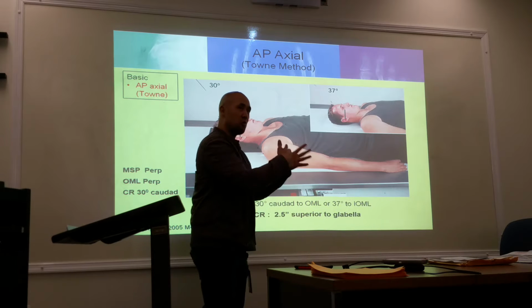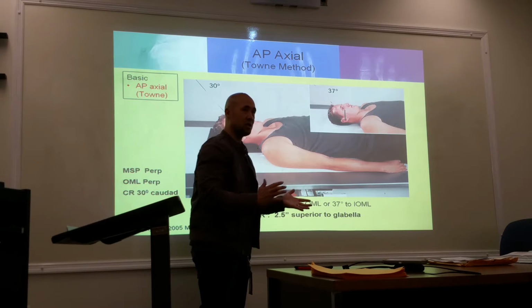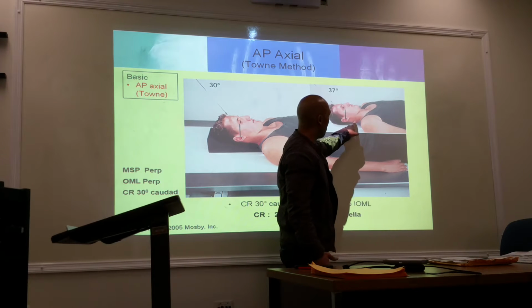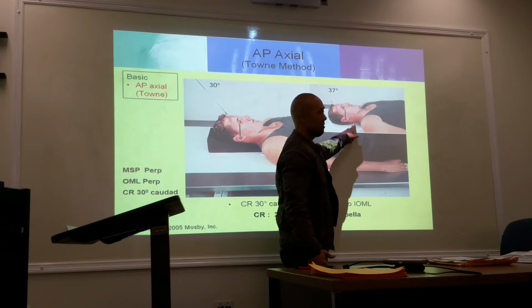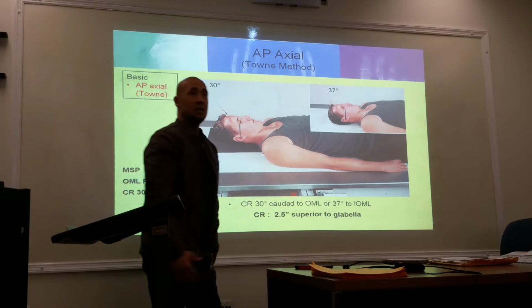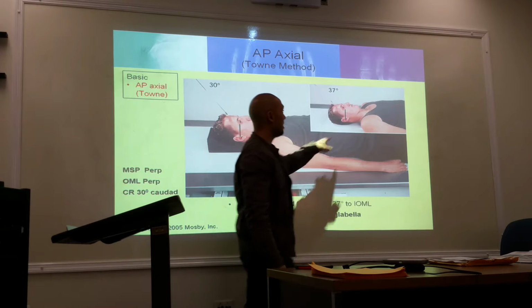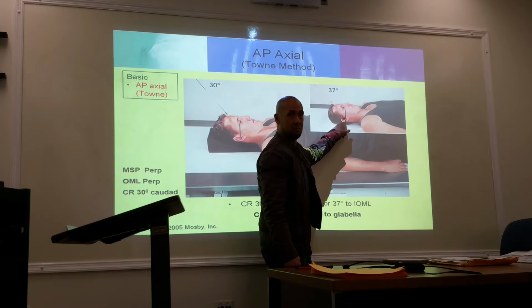Especially if, let's say you got rear-ended by a car, now you got whiplash. You're not going to be able to do this. Okay? You're going to come in a more relaxed position here. Just do a steeper angle. Right. So now the baseline is going to change. We're not using the OML, we're going to use the IOML.